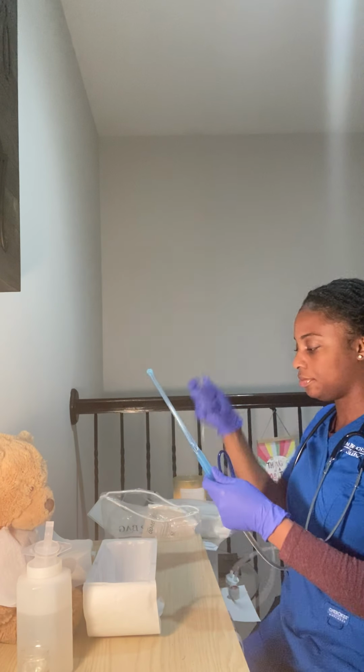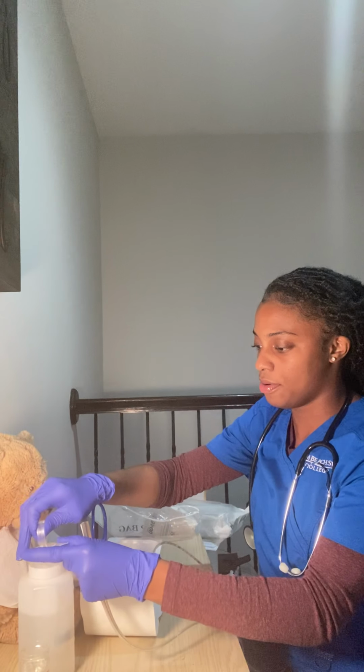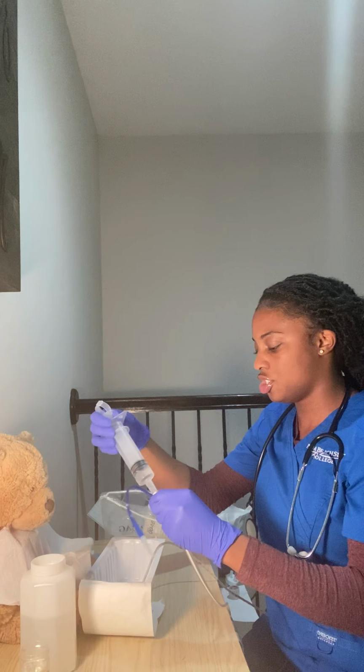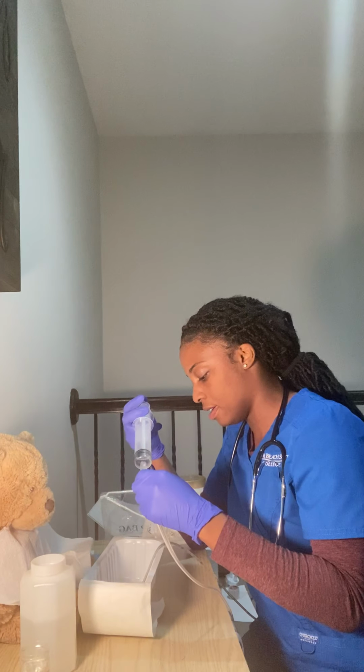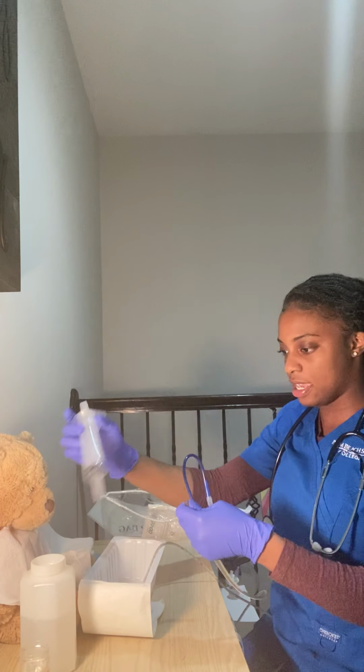And it does. I'm also going to go ahead and just push about 10 mLs of water into here just to check to make sure that my catheter does work, and it does.